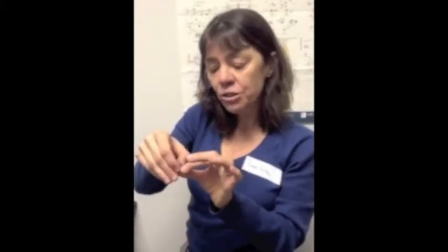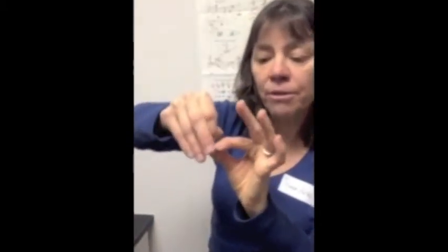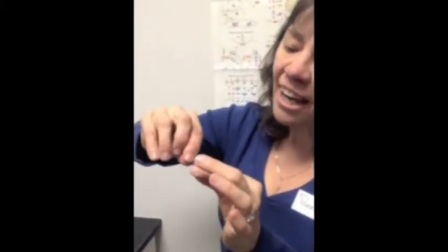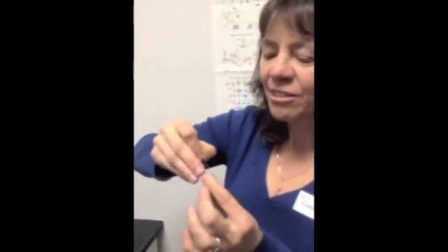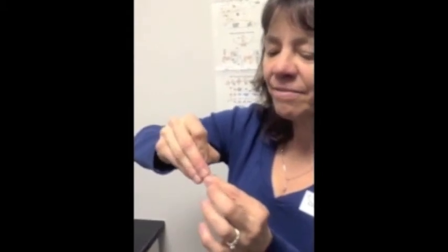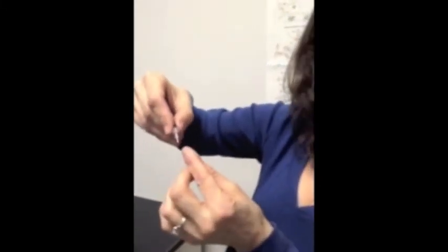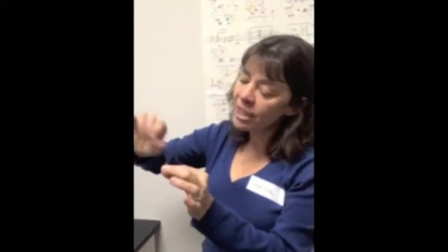Once it's time to do the experiment, we can then insert this probe into the guide cannula. This one's not wanting to go in very well. And you can see a little bit of it comes out the other side, and it's covered with a semi-permeable membrane. And once we start the experiment, we can actually perfuse a salt solution, artificial cerebrospinal fluid that's designed to mimic the fluid that's in your brain.